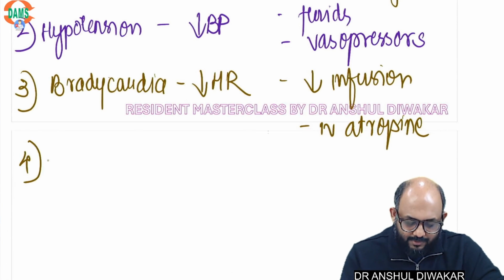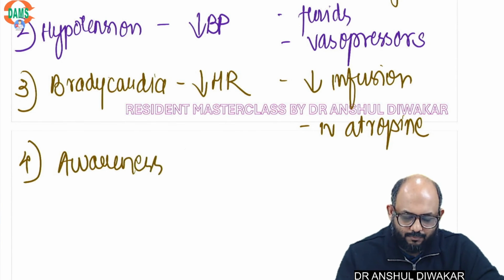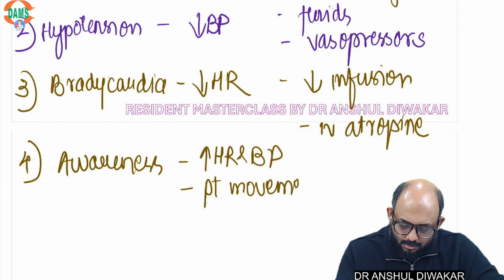You can have awareness. Suppose you are giving inadequate anesthesia, what you will see? You will see increase in heart rate and blood pressure on the monitor. You will see patient movement and autonomic response.